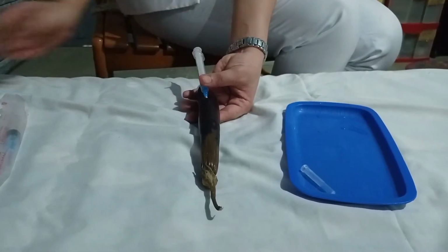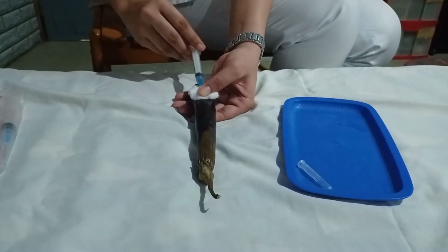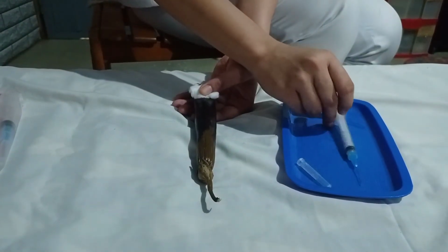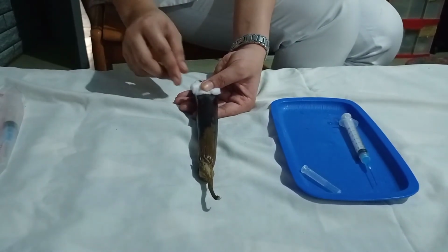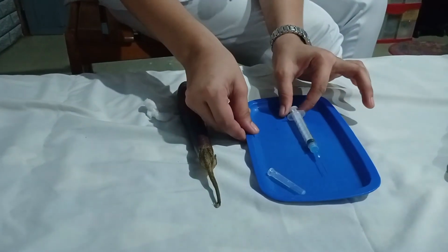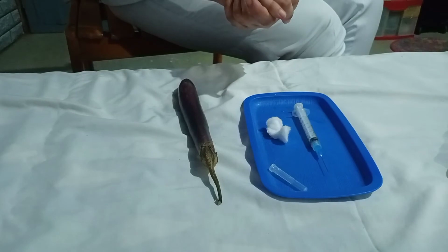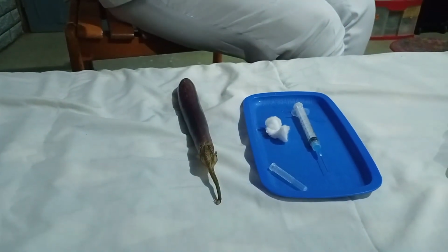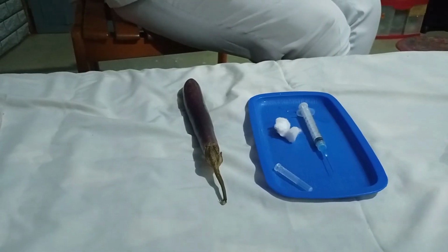Get the cotton and place the syringe in its proper place. Do not recap the used needle; discard the needle and the syringe in the receptacle. Wash your hands, document in the nurse's notes, and request the resident to interpret the results for 30 minutes. The rationale is to prevent prick injury, and the rationale for documenting is that documentation prevents medication errors.